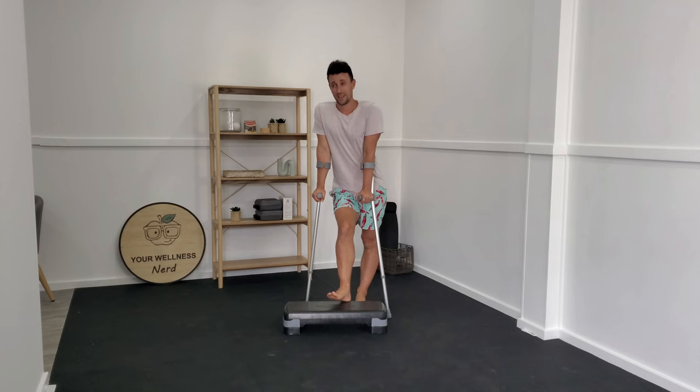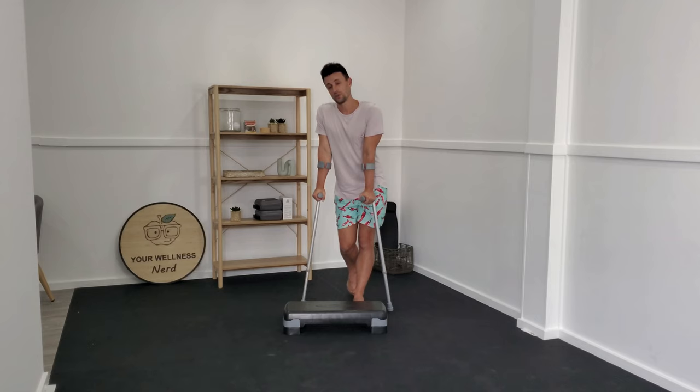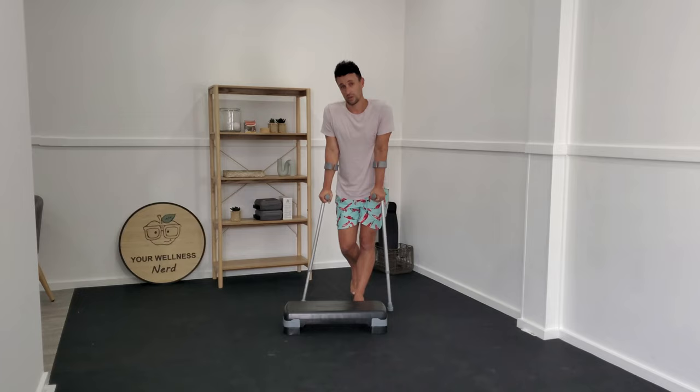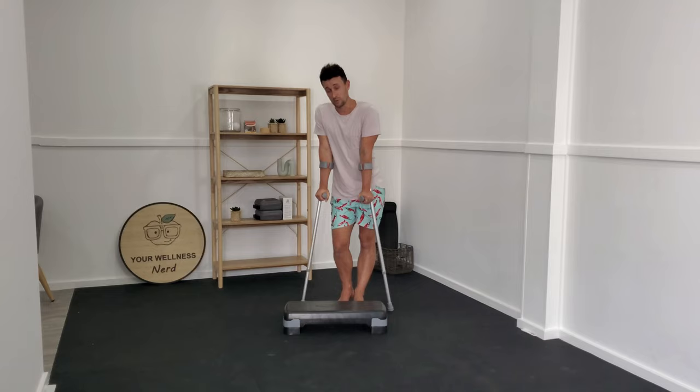Another important consideration is how to navigate stairs. It's always important to be prepared so we can decrease the likelihood of a fall or aggravating your condition. This becomes obvious if we think about the principles of why you have your crutches. A mnemonic I was taught in physio school is: good go to heaven and bad go to hell. When going up, you want your good leg or unaffected leg going up first. When going down, you want your affected leg or bad leg going first in front of you.